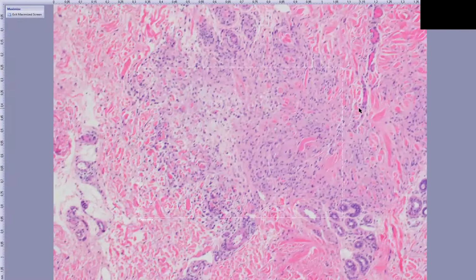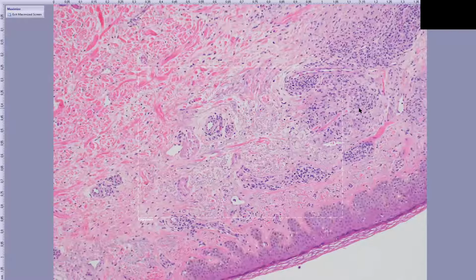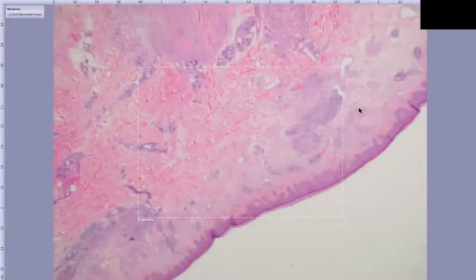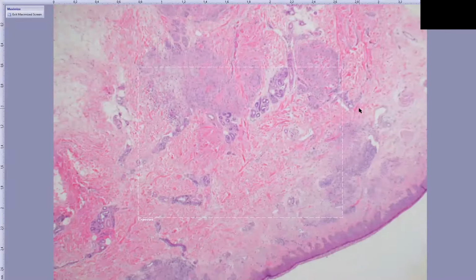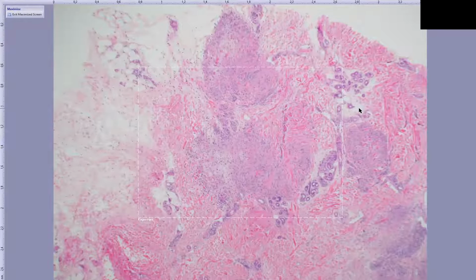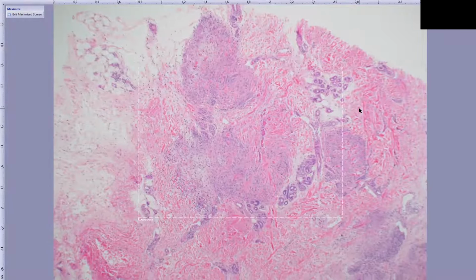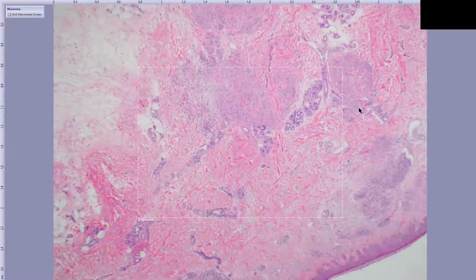It doesn't leave behind sclerosis as it resolves, okay? Which is the case in necrobiosis lipoidica. So GA's prototypic feature is the palisaded granulomas, versus the horizontal tiering of necrobiosis and histiocytic infiltrates in necrobiosis lipoidica, and the presence of mucin deposition within zones of collagen degeneration, versus in necrobiosis lipoidica, you don't have that.